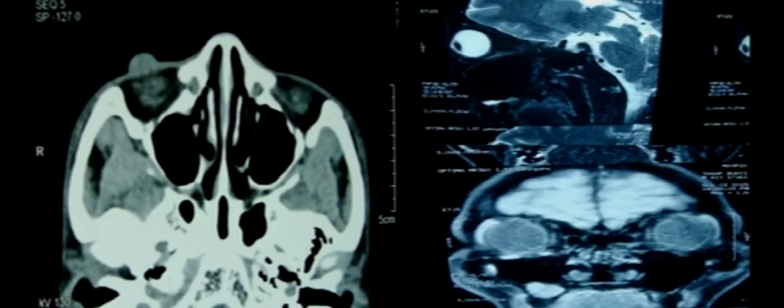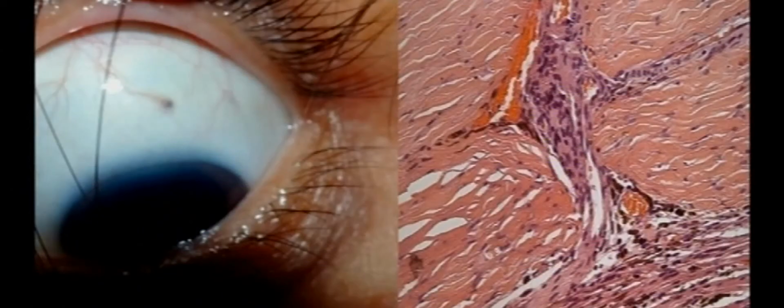And here this patient has an involvement inside. So melanoma will be HMB45 positive. And this is again a melanoma case. You can well appreciate the vascularity.